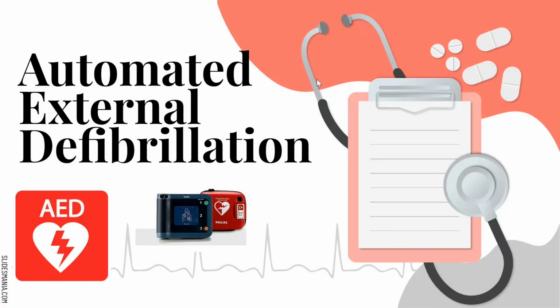This Medical Monday, one of our last ones, we're actually going to be talking about the AED. Last week we talked about CPR, the week before we talked about heart attacks. So this week we want to wrap it all up. We're going to talk about AEDs, exactly what is an AED, when you use the AED, where you can find the AEDs, things of that nature, and exactly what AED stands for. So that's what we're going to be talking about. Automated external defibrillator is what the AED actually stands for.